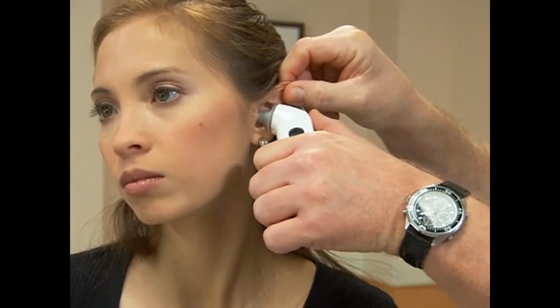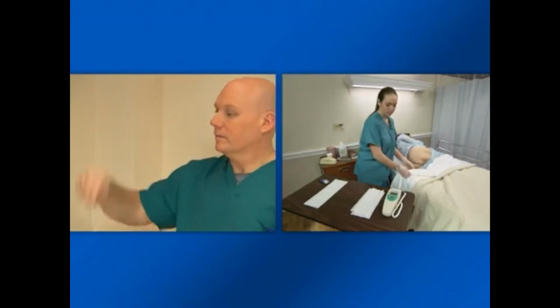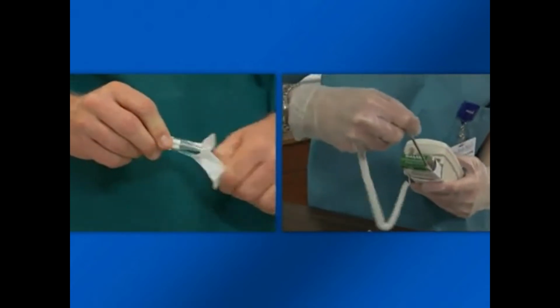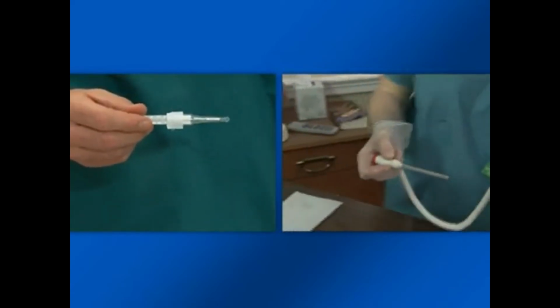While rectal temperatures are considered the most accurate, this method should be used only if other methods are not practical. If using a glass rectal thermometer, prepare it by shaking it down. Apply the appropriate cover, then lubricate it.